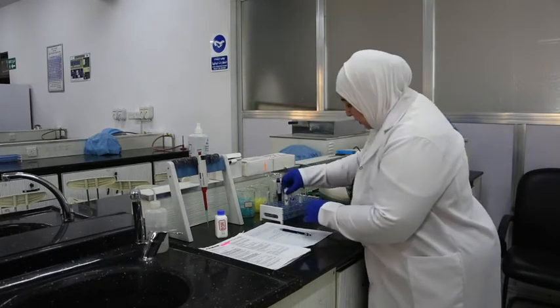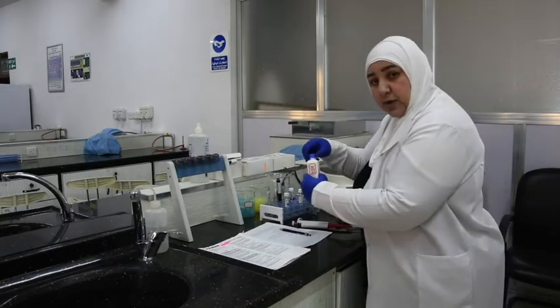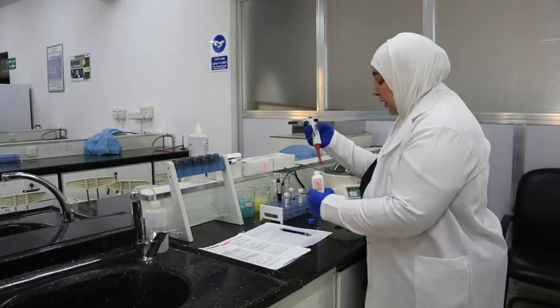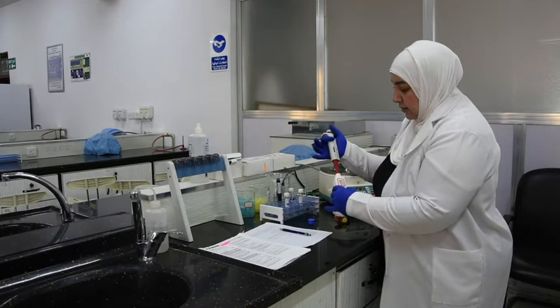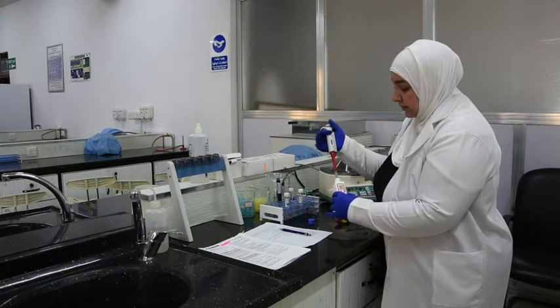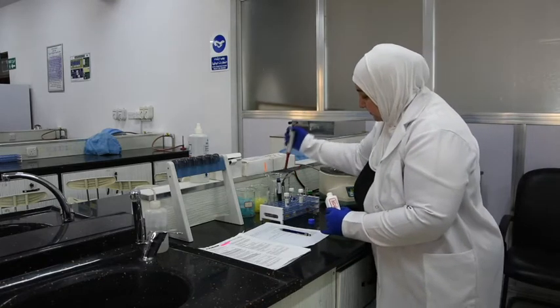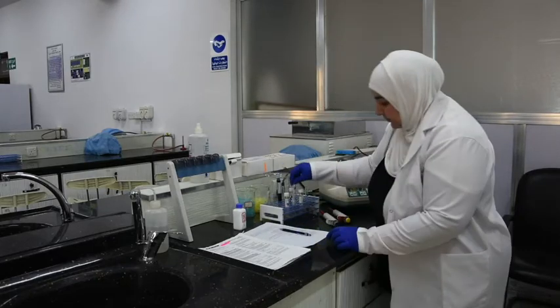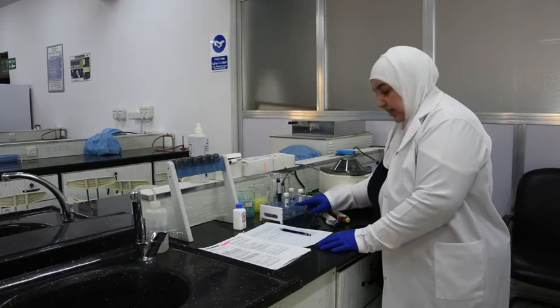Then we add the reagent, the HDL cholesterol reagent that has phosphotungstic acid and magnesium ion, 500 microliter, and add it to the serum. Mix and leave on the bench for 10 minutes.